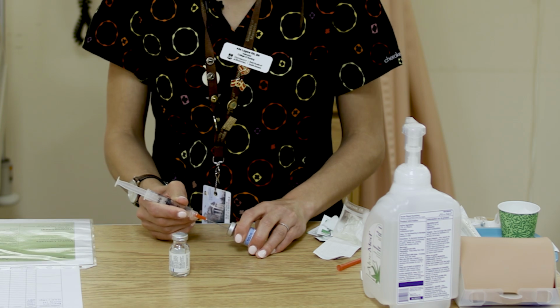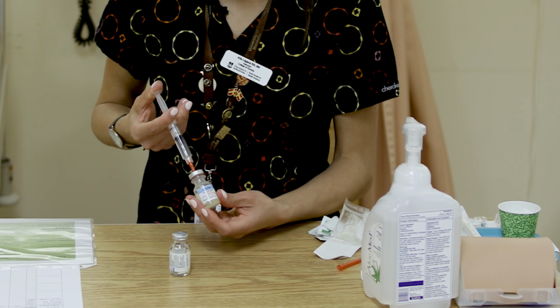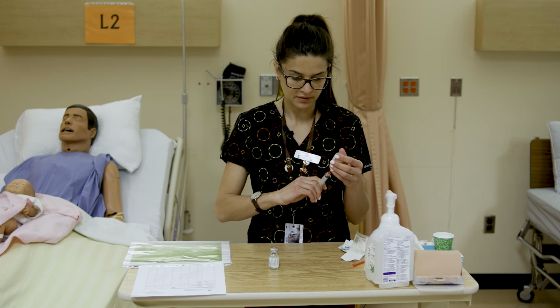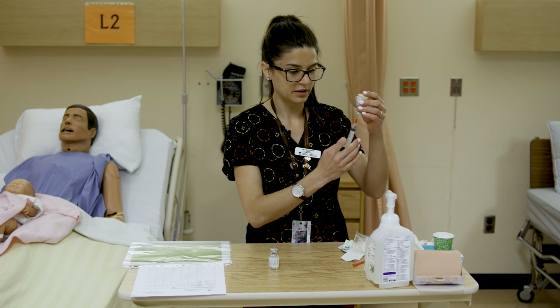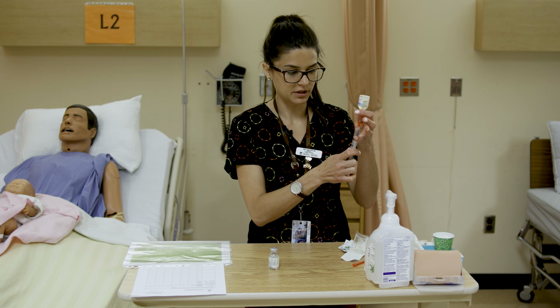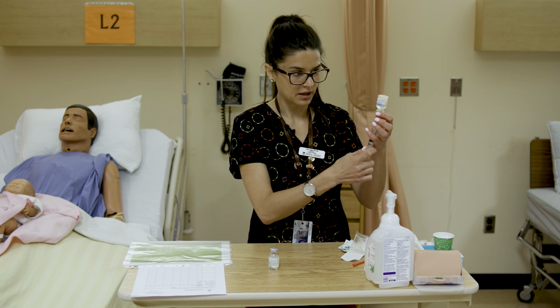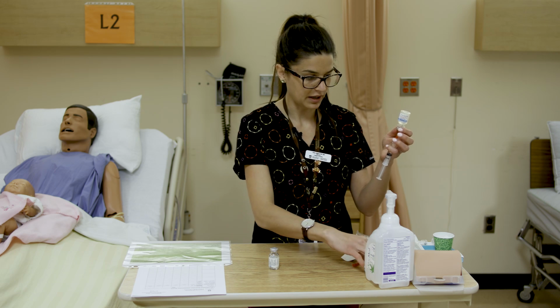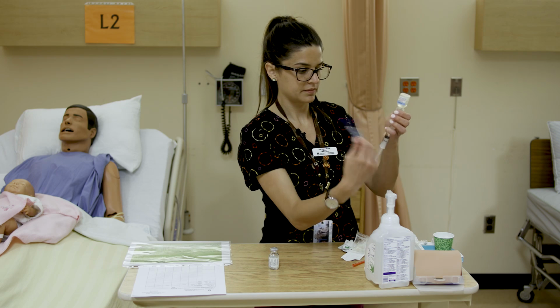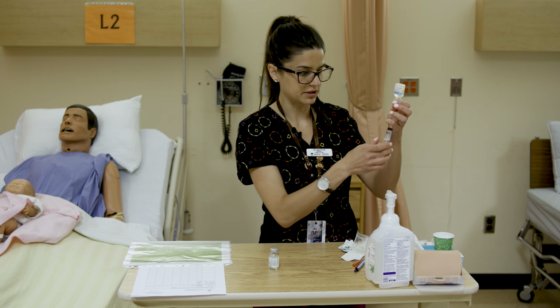So we're going to go into our sterile water and we're going to inject our air. We're going to flip it upside down so we know we have our 3.5. Typically it will kind of push the fluid out for you, but you may need to pull on it a little bit to get it going. And again, keeping your blunt fill within the fluid there, and we're going to give it a tap. Get those bubbles off. They typically tend to sit on the plunger there.